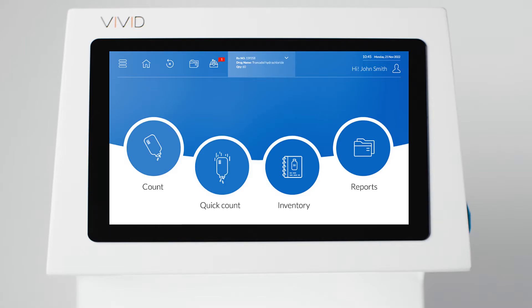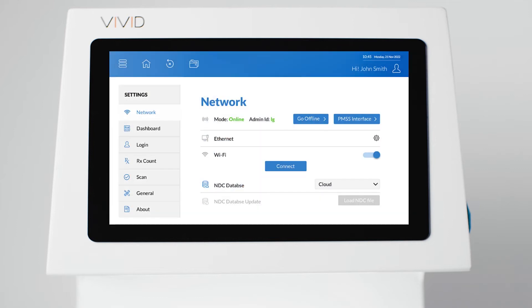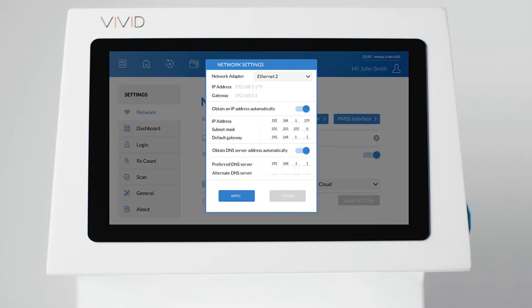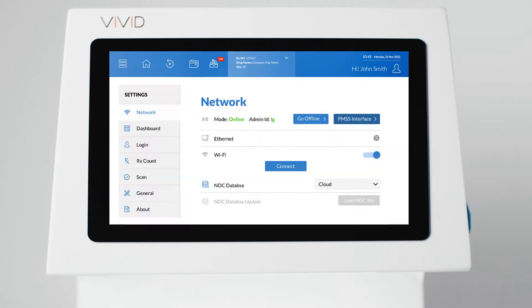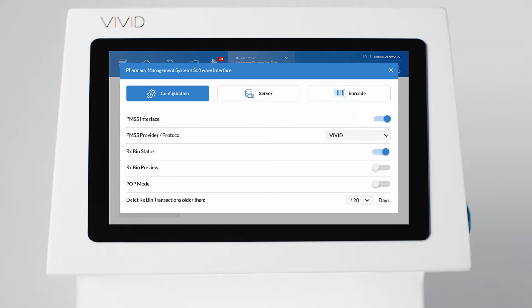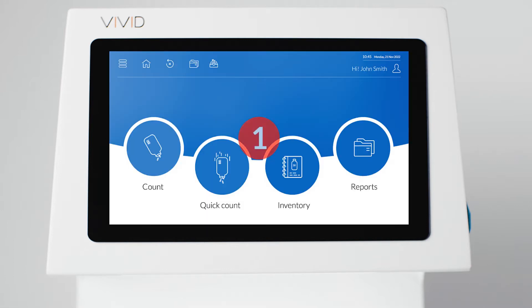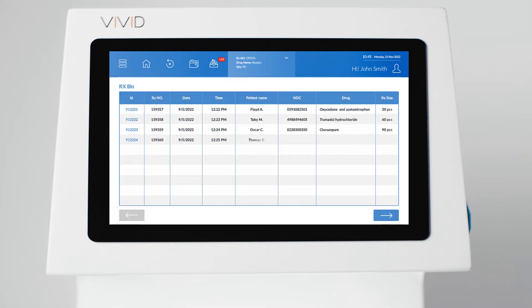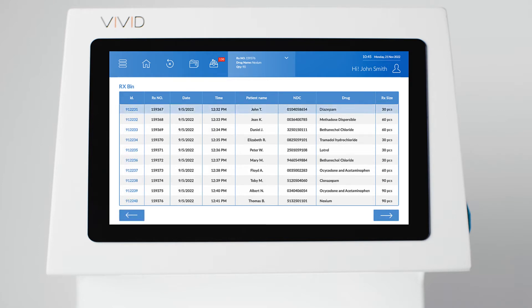Welcome to Vivid. In this short tutorial, we will explain the Vivid pharmacy software interface and help you quickly connect Vivid to your pharmacy management system. When interfaced, your Vivid pill counter receives transactions directly from your pharmacy software and becomes an integral part of your workflow, streamlining the prescription filling process. Enabling the interface will maximize the functionality of your Vivid and save you time when counting.